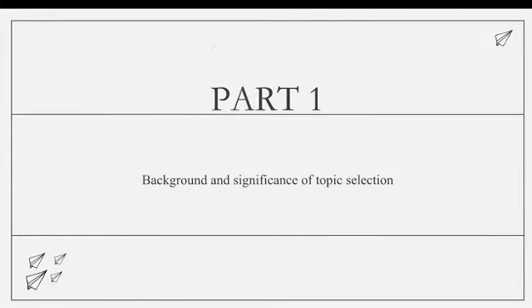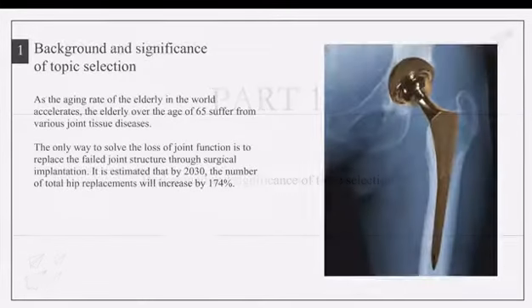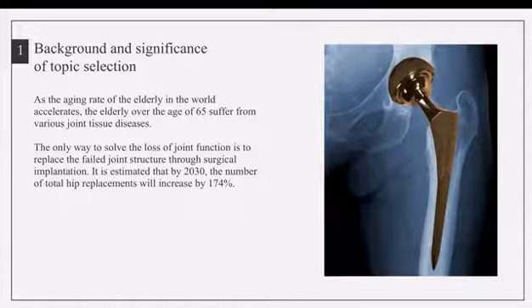The first one, background. As the aging rate of the elderly in the world accelerates, the elderly over the age of 65 suffer from various joint tissue diseases. The only way to solve the loss of joint function is to replace the failed joint structure through surgical implantation. So I researched the method of metal injection molding to make artificial hip joints.